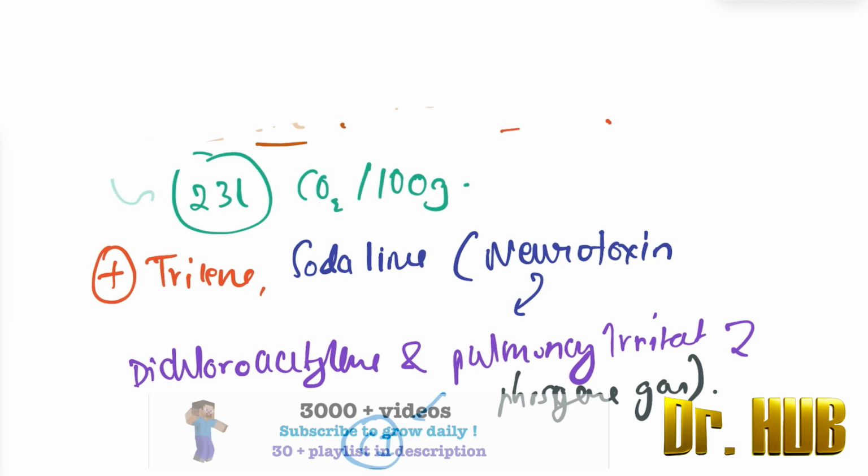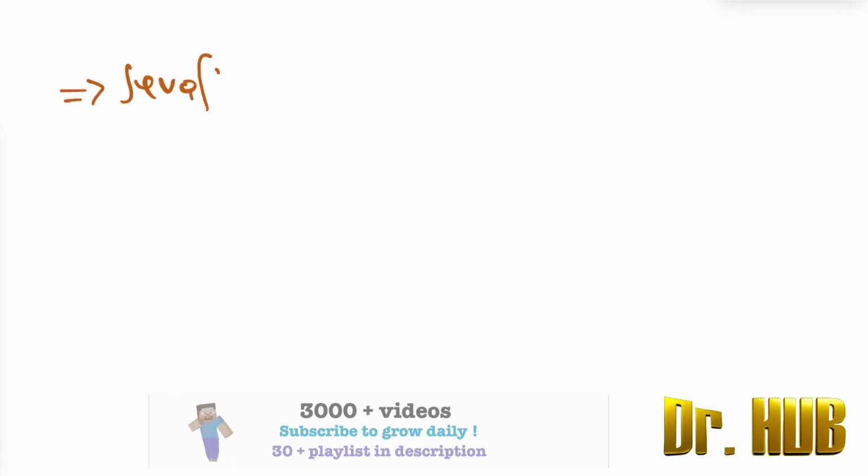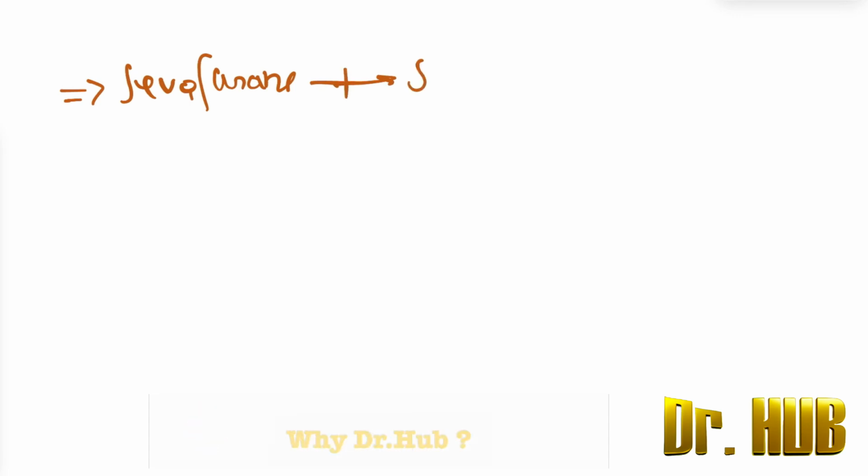Next, the sevoflurane reacts with the soda lime and produces a compound A.